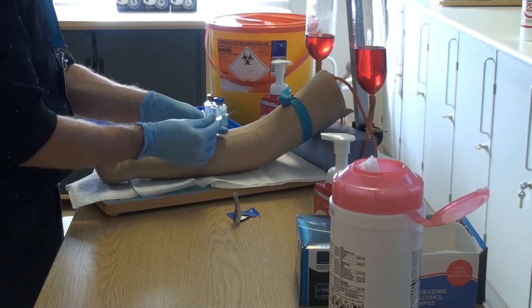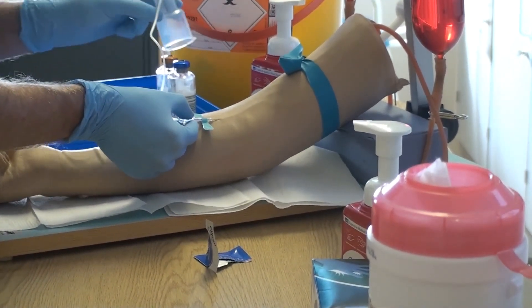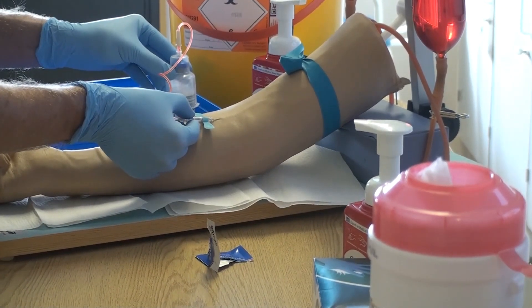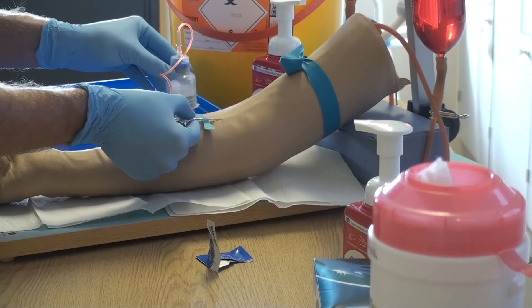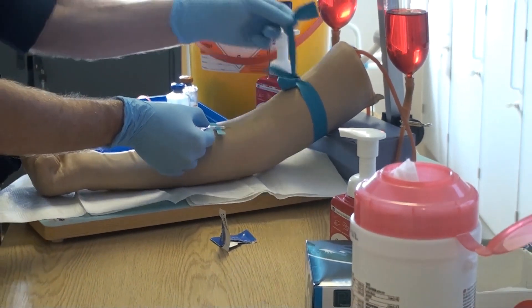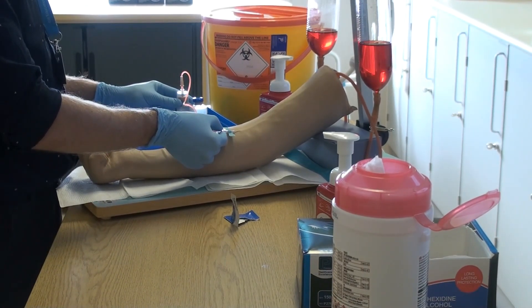Remove the safety from the winged device, anchor the vein, and insert the butterfly at a 20 to 30 degree angle as per venipuncture. Apply the top of the device to the aerobic bottle and allow 10 mls of blood to enter the sample — this is indicated on the side of the bottle in 5 millilitre increments. Remove the vacuette and release the tourniquet, then repeat the same on the anaerobic bottle until 10 mls is obtained.